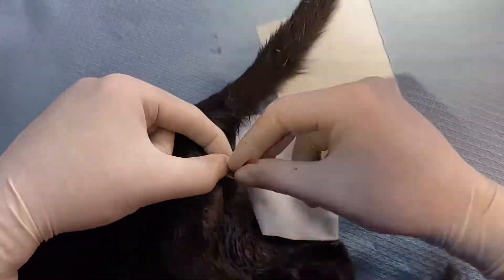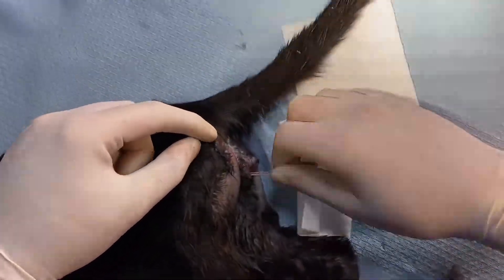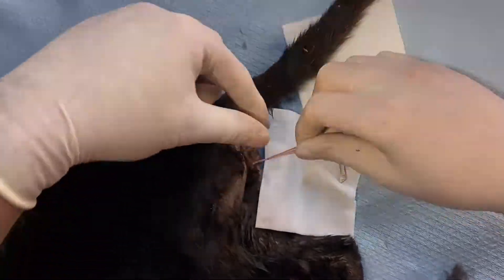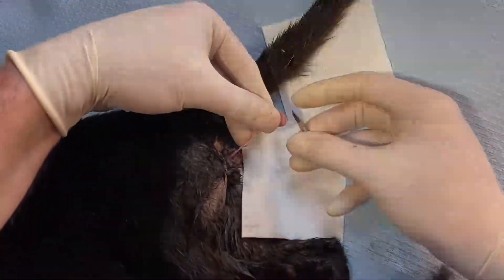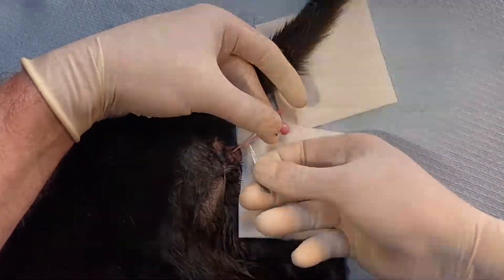Let's do a little more, and then you can see them all — the little knots stacked up. Then we make our incision about a centimetre past the last knot.